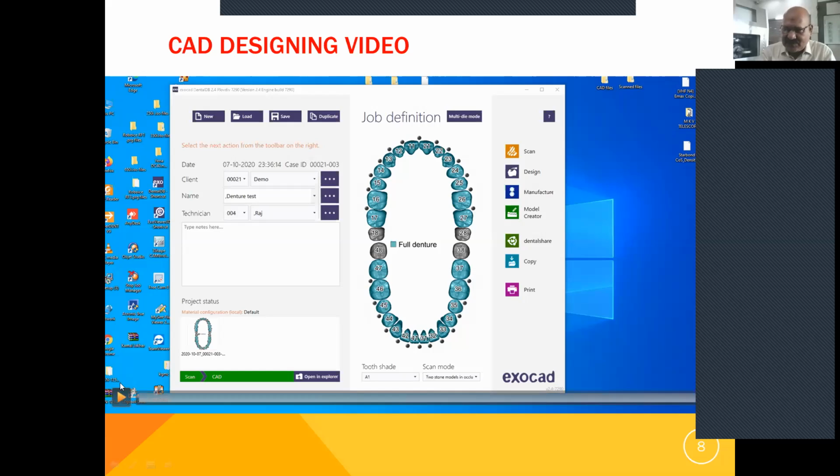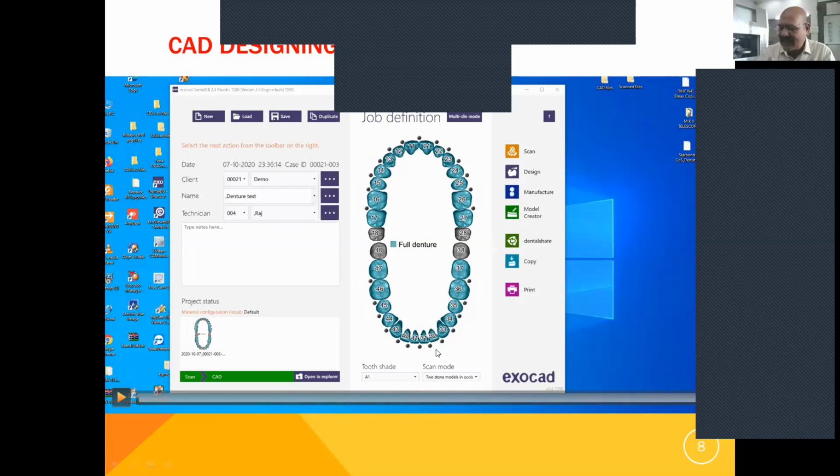Maybe you have to bear with me. Yesterday I recorded this, and if need be, I need to transfer the file. This laptop is very slow. I'm trying very hard to transfer the scan data into this, so I could show you live. I copy the data from the other PC. It is just too slow, so it's not allowing me.